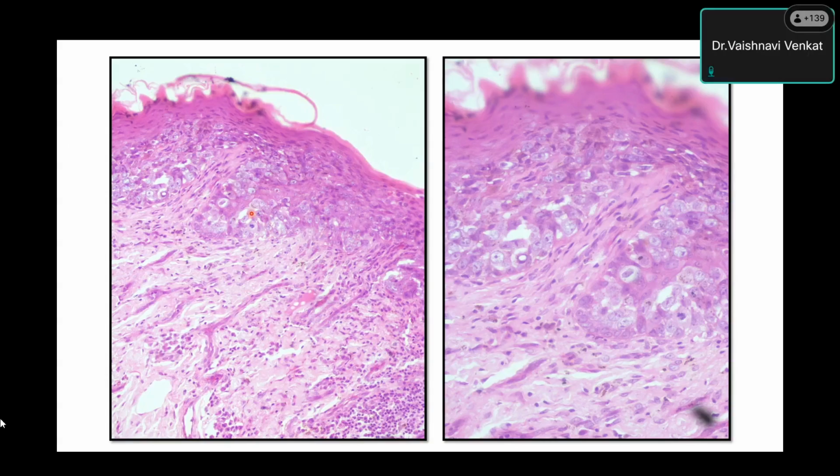Cells, they are vacuolated. They have a pale nucleus, eosinophilic or vacuolated cytoplasm. The nucleus is also large, round, and you can see here it is showing a prominent nucleolus. Now, why is this pale vacuolation there in these cells?